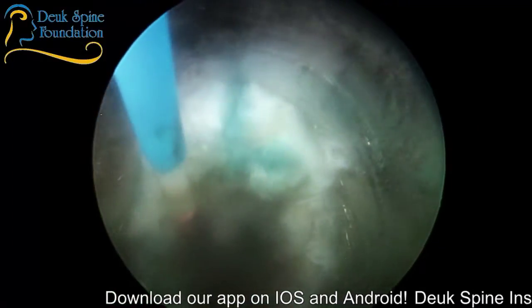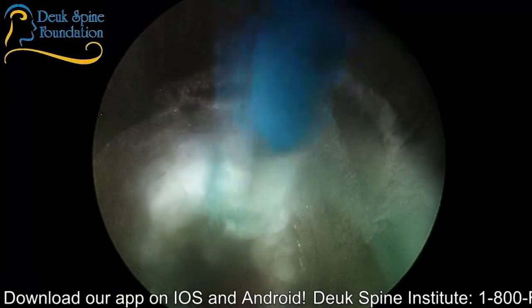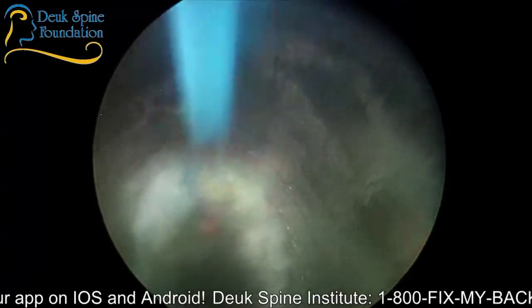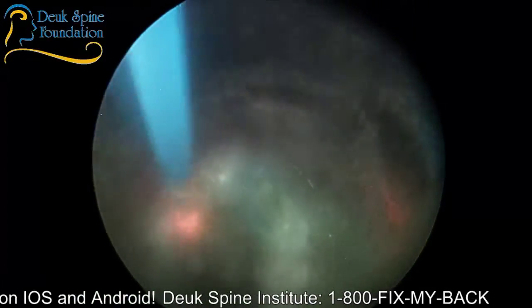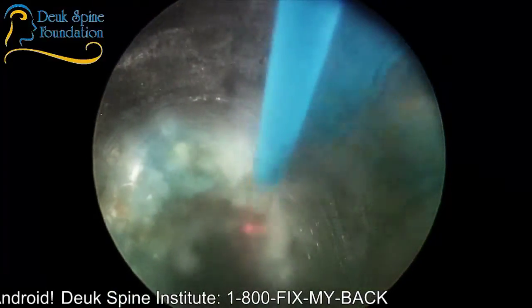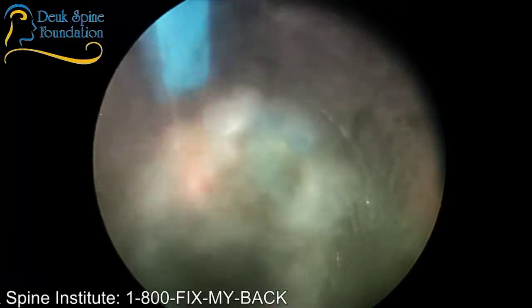You see that? So the white is the annulus on both sides of the tear, and the blue line represents the tear. That's where the dye leaked out through that tear. I know it's kind of hard to understand three-dimensionally, but that is the tear, and that's what we're vaporizing away. We're basically cleaning out the tear.